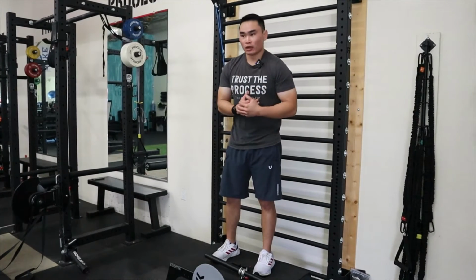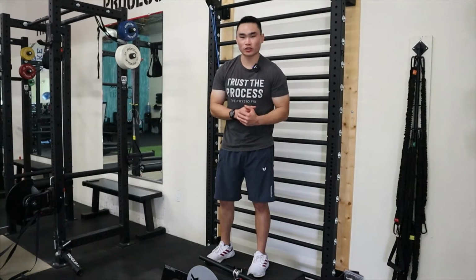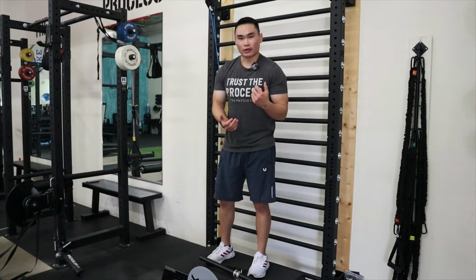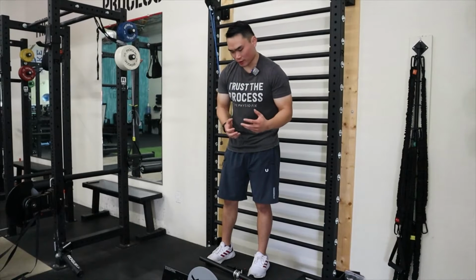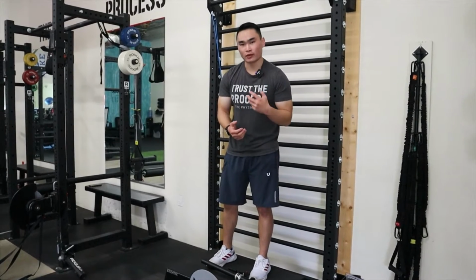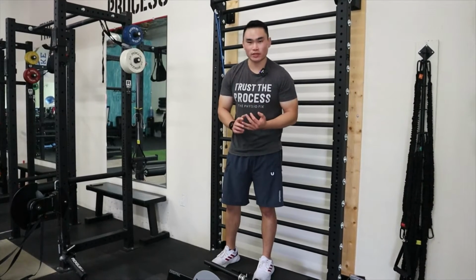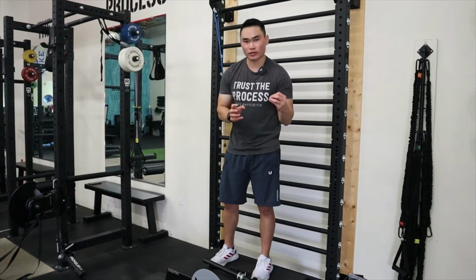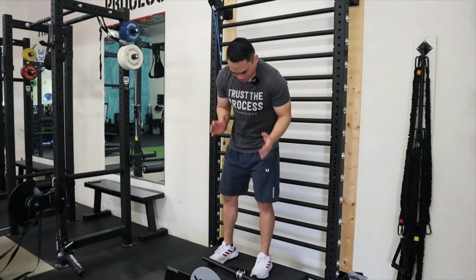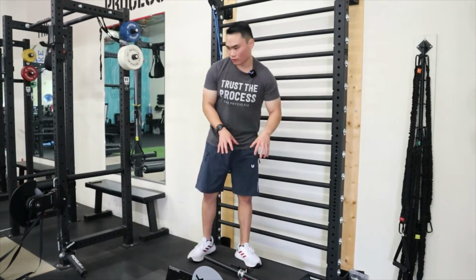As a clinician, I'll tend to provide a little bit more verbal encouragement to my patients. So I'll say push, push, push. I feel more like a strength coach when I work with patients on these machines, because I want to pull the most out of them. And research shows that when you provide verbal encouragement with a higher frequency, it tends to get the most out of someone. So anyways, that's just how this Kbox works.